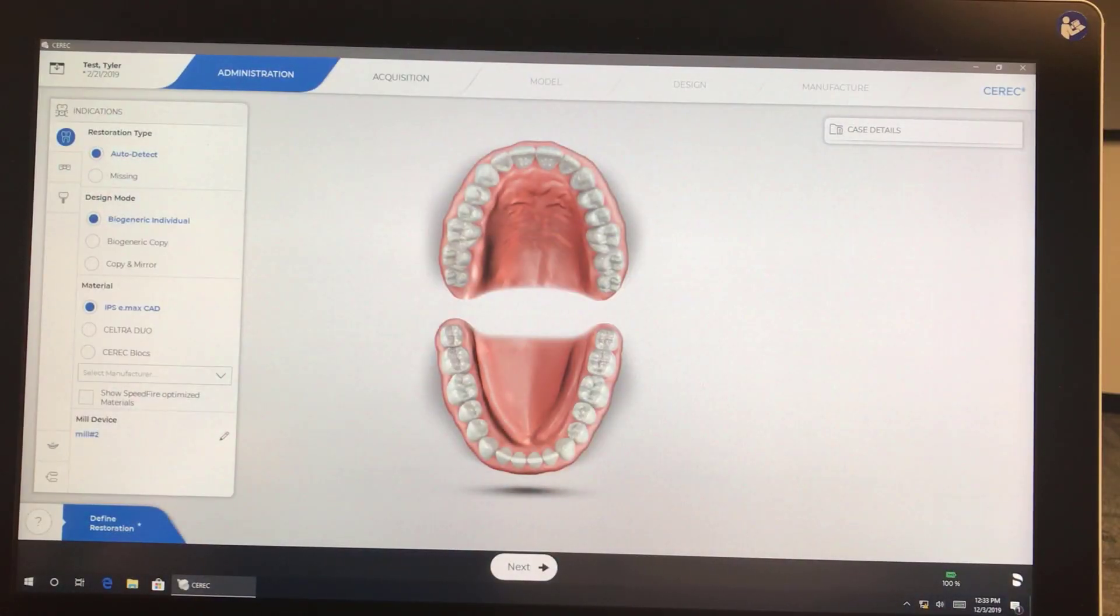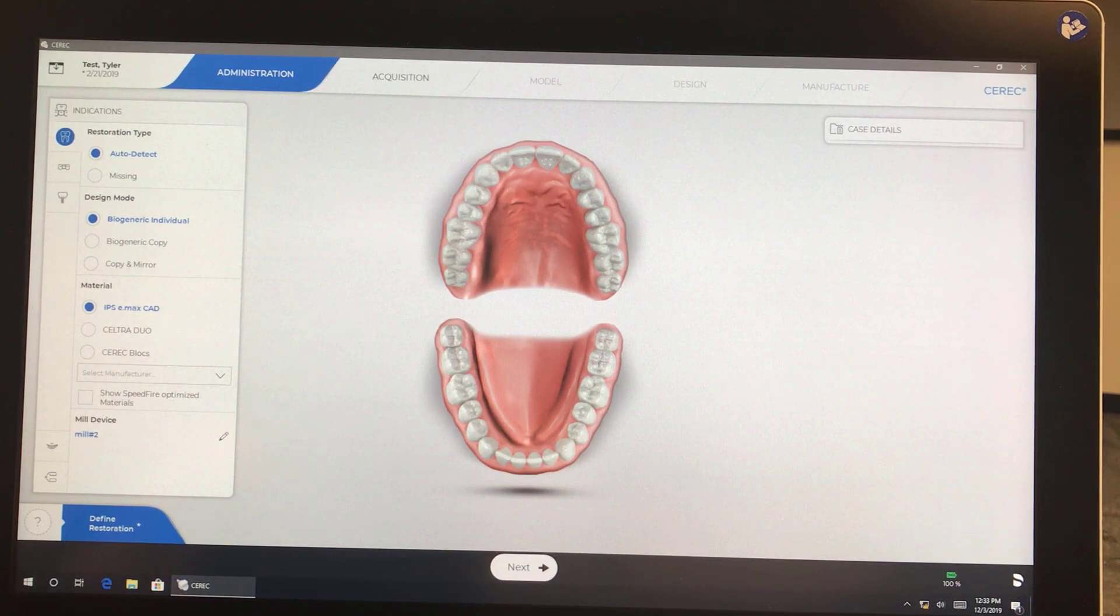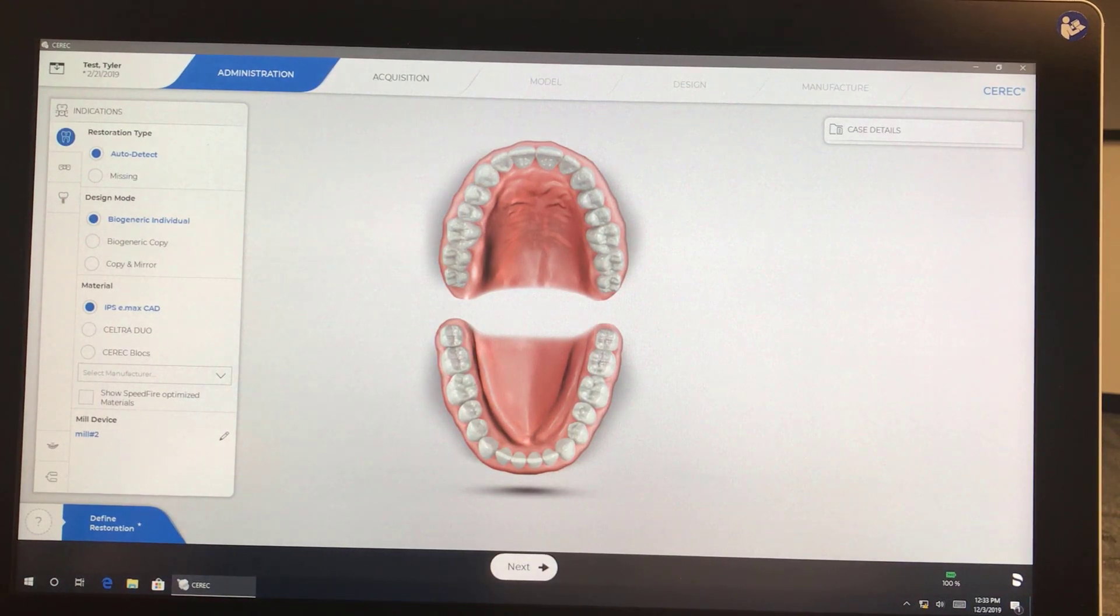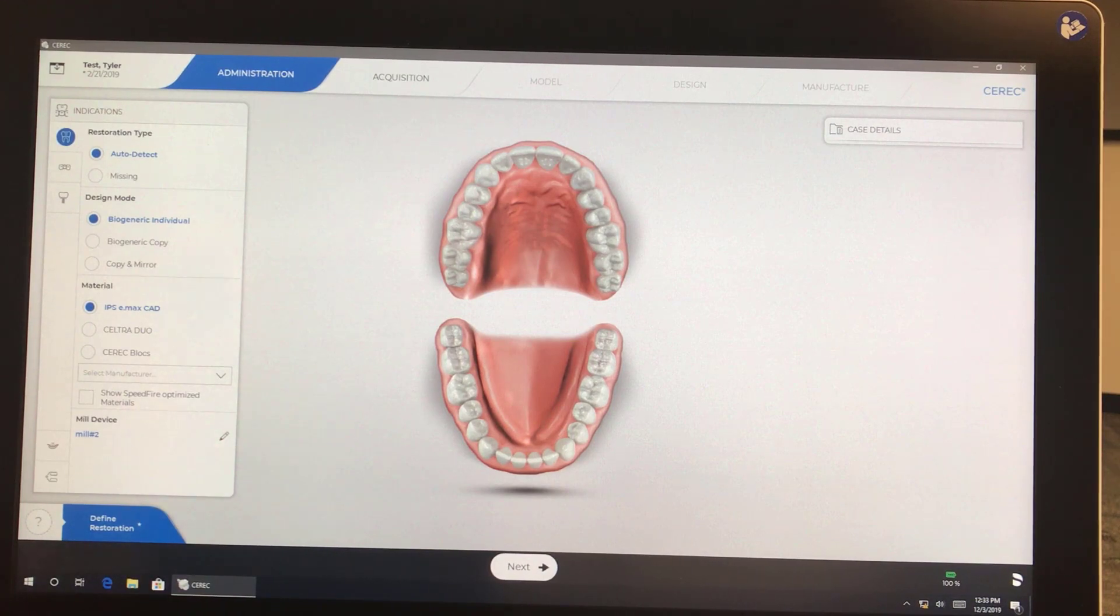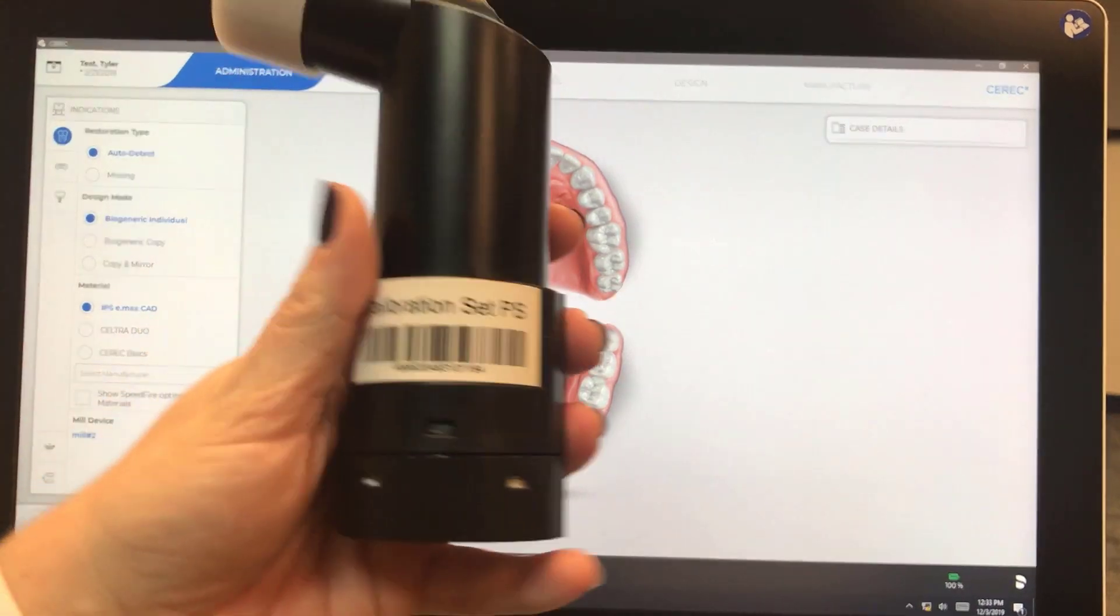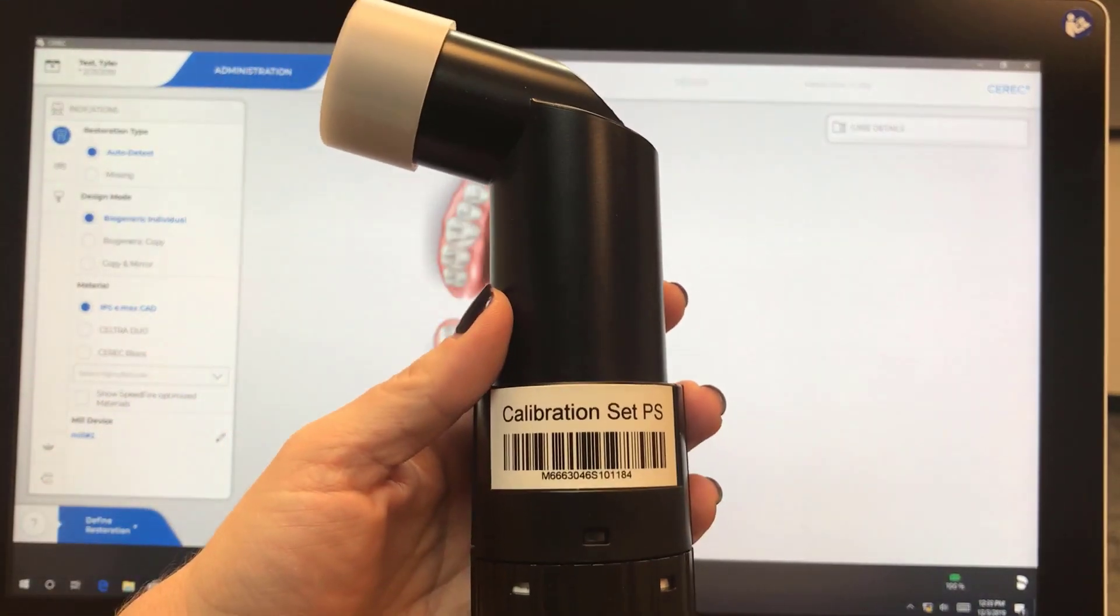I'm going to demonstrate to you how we calibrate the PrimeScan camera. Well, first and foremost, you need your calibration tool. So this is the calibration set for the PrimeScan.